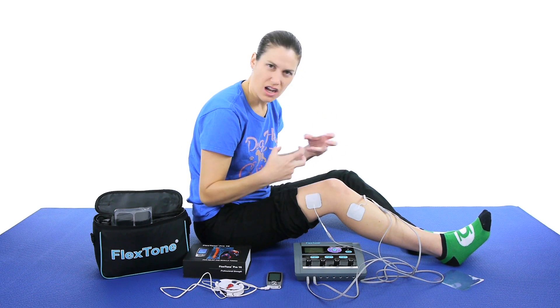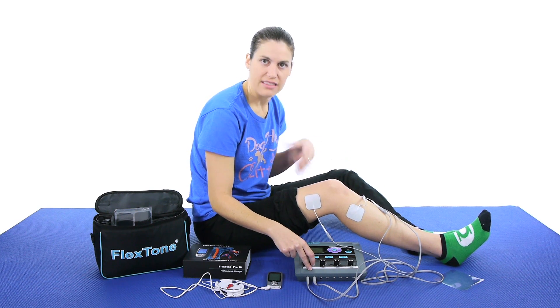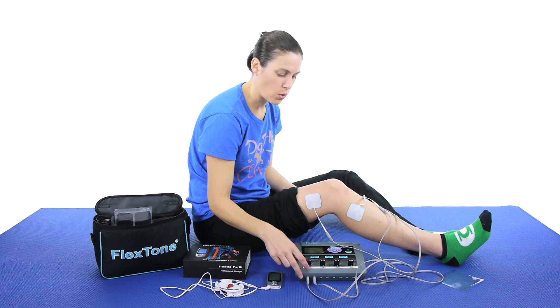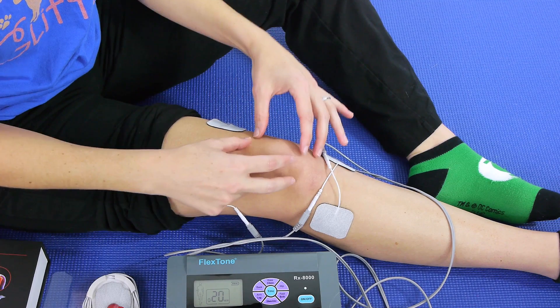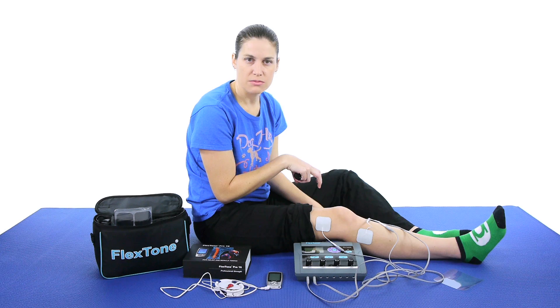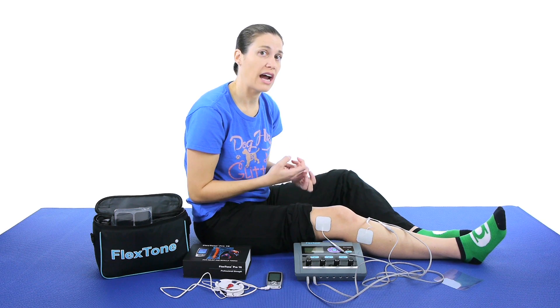So like I said, it's a massagey kind of feeling. It feels really good, and it's up to you how strong you want it. If you're kind of worried, you don't have to have it on high. The higher is not better — it's just for your comfort level. Some people actually like it pretty high because if you're hurting, the higher you go it'll cancel out that hurt a little bit more. And for the TENS, you just have it on and relax. As you can see with the TENS, you're not supposed to see a muscle contraction — I think that's where people get confused. If you actually see the muscle contracting, it's not quite doing what it's supposed to do. So you either turn it back off and move the electrodes around a little bit, or just take the power down a little bit. You don't want that muscle contracting for the TENS.